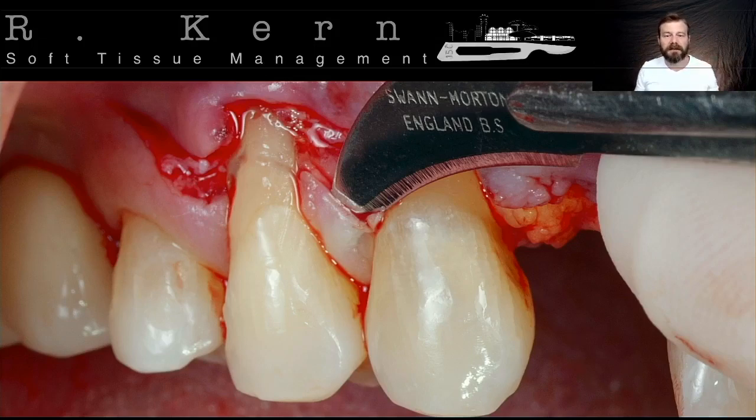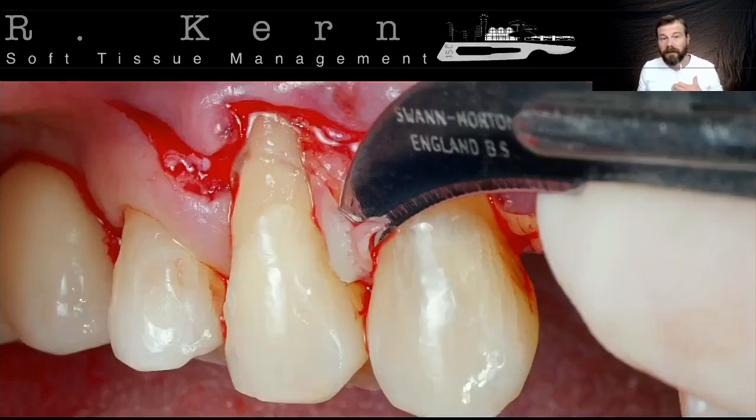Sometimes I smash the tissue. A good micro scissors to do that is quite expensive, and a high-speed bur with fine grit is also good, but the fastest, cleanest way is the 12 blade, in my opinion. Of course, everybody has a different trick and gets used to a different technique, so I'm just telling you my perception here, right?